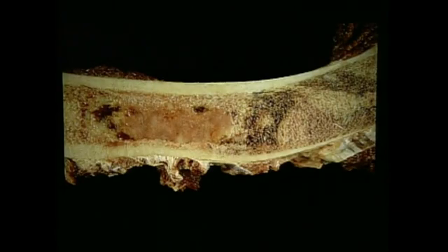Here again, multilobulated, looking firmer than in other maybe species. And then affecting the bone marrow as well, replacing large portions of the marrow. So a secondary diagnosis would be of a myelophthisis, and indeed this animal probably had changes of disorders of coagulopathy or thrombocytopenia. Here again a close-up, just like in a cow. In this horse, part of a multicentric lymphosarcoma form. Here to show thrombocytopenia and a coagulopathy associated with lymphosarcomatosis, multicentric widespread lymphosarcomatosis. Probably that might be the same animal.